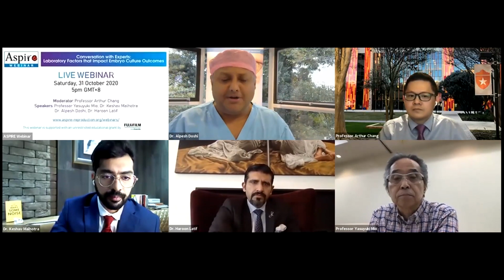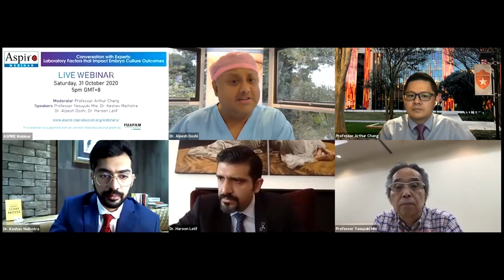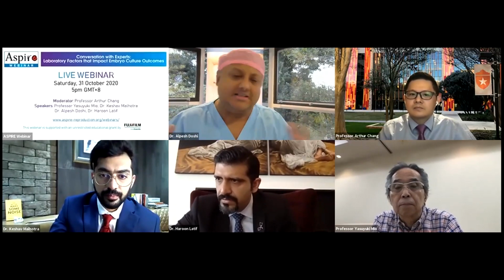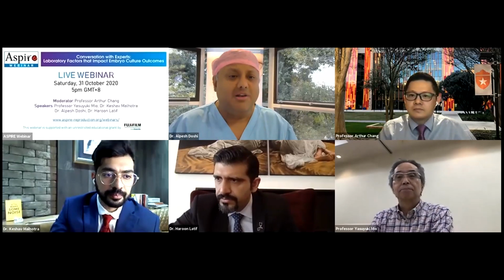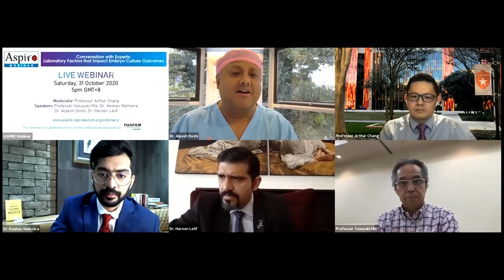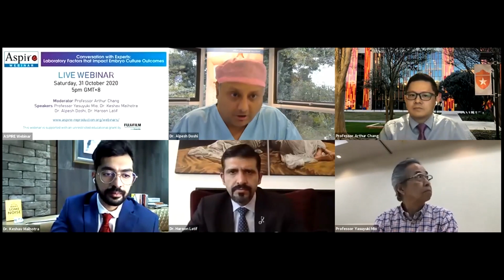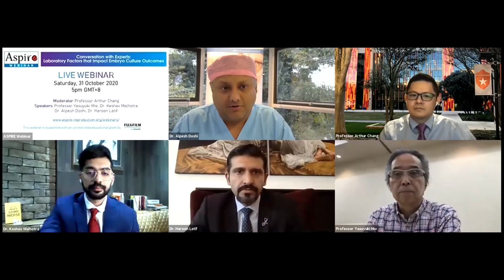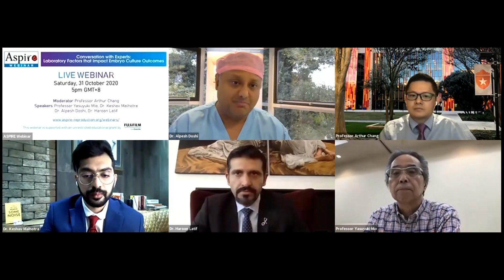But I appreciate that there are a lot of times we have to do PGTA on frozen embryos because the patient hasn't been pregnant or for various reasons. In such cases, I have to end up making the opening on day 5 after thawing. I usually find that biopsy becomes a bit more difficult because these trophectoderm cells are very tightly cohesive. And I end up using the flick technique a lot in these embryos where I haven't made an opening on day 3. But perfectly both viable strategies, and it's on personal preference.